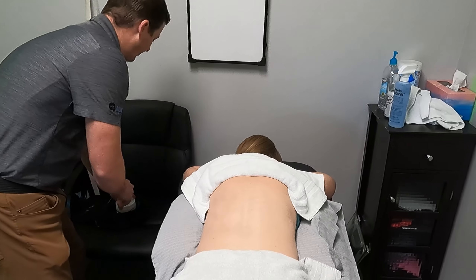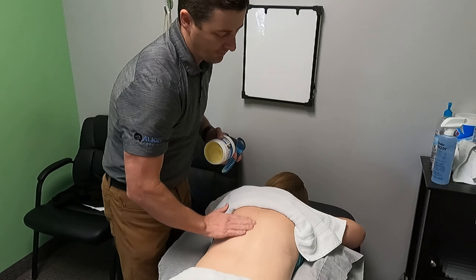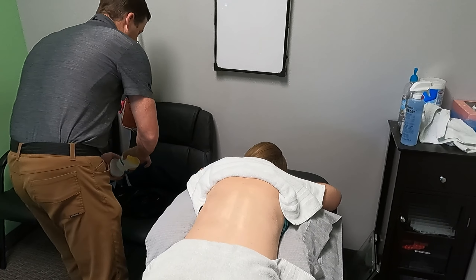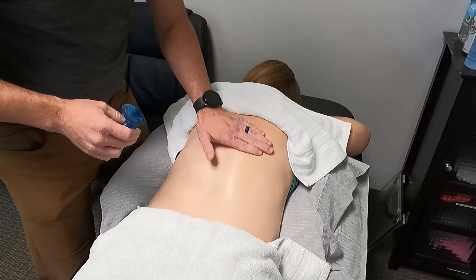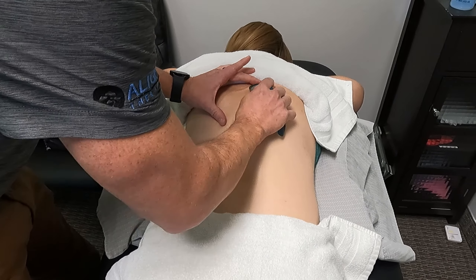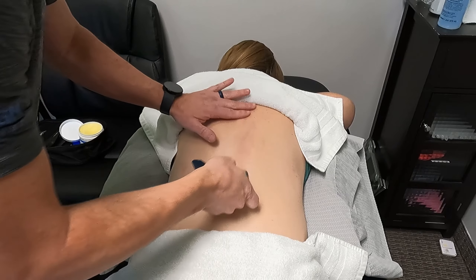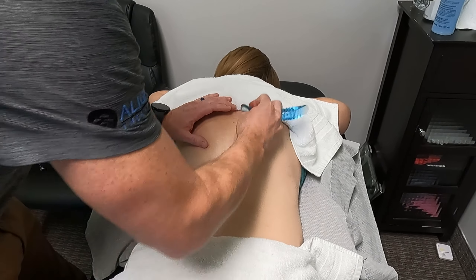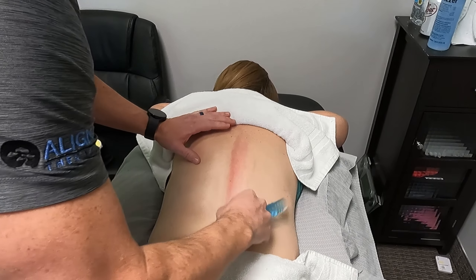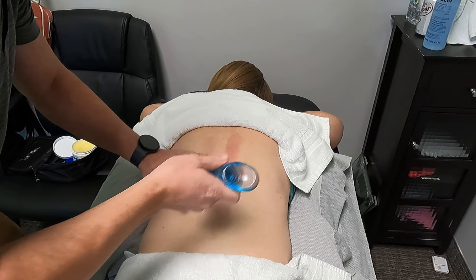Now with ASTYM, I'm going to put a little bit of cocoa butter on her back just to provide some lubrication on the skin. For this, I'm just going to follow up on the paraspinals. I usually tell patients to give me feedback on how much pressure I'm putting — I'm putting a specific amount of pressure, but they do have a say in this. So if I'm pushing too hard, they can tell me.